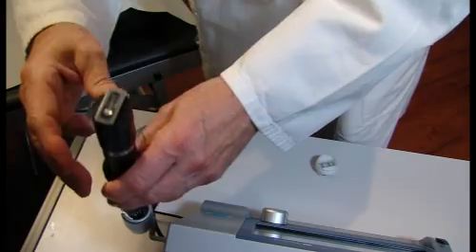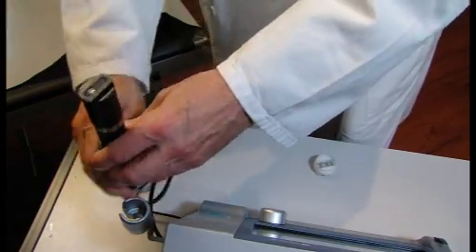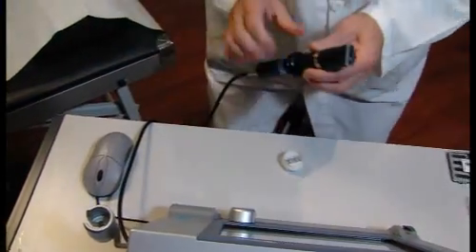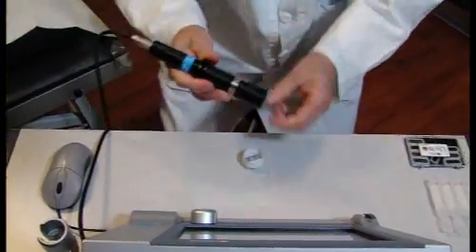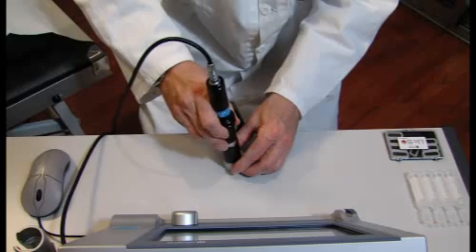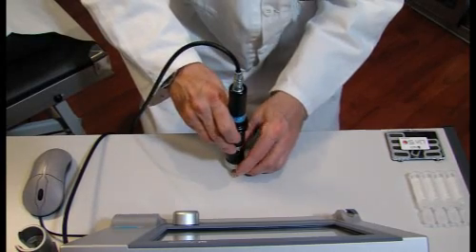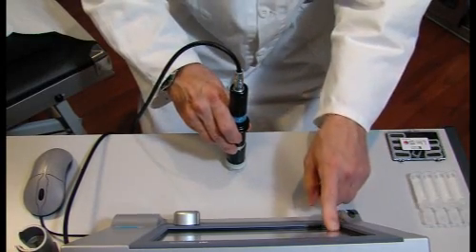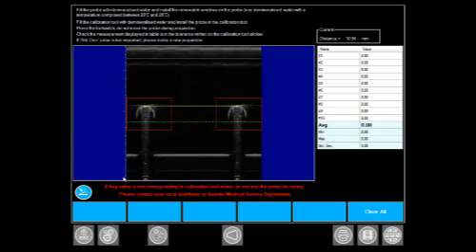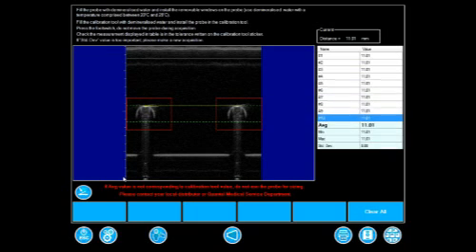The doctor picks up the probe and places it on the checking tool previously filled with water, then presses this button to start the automatic calibration. The checking is now complete.